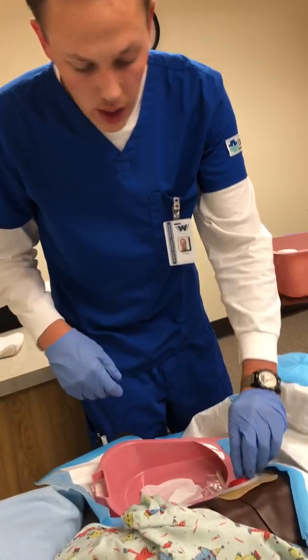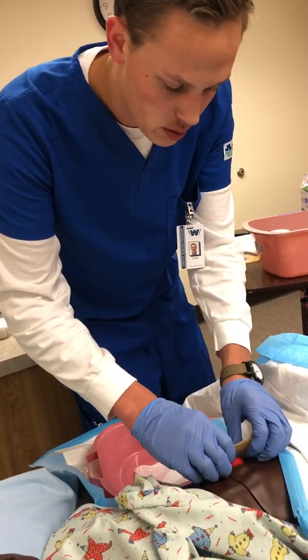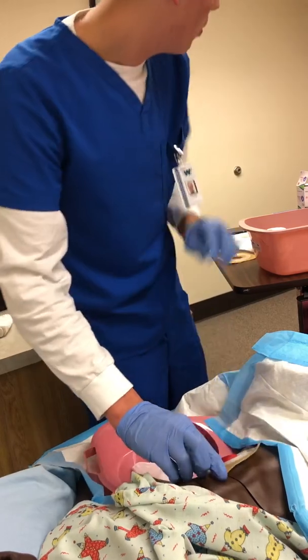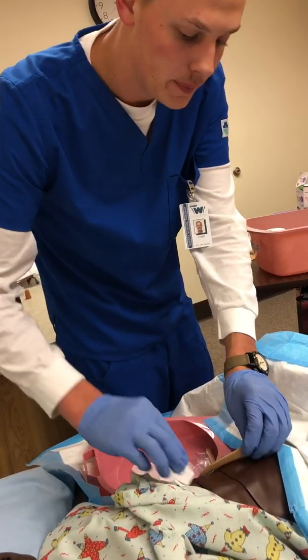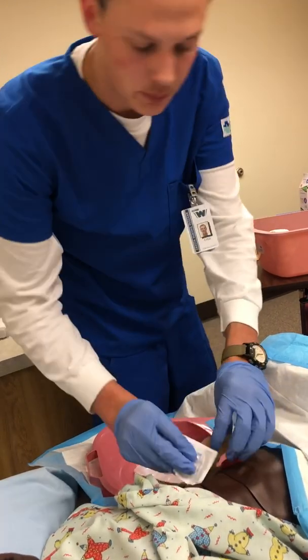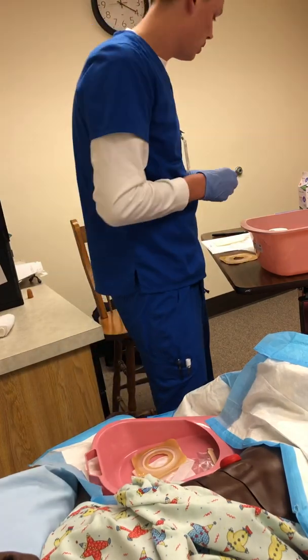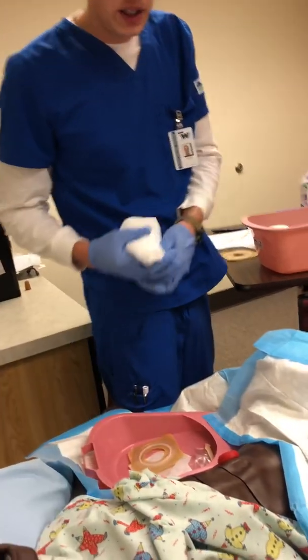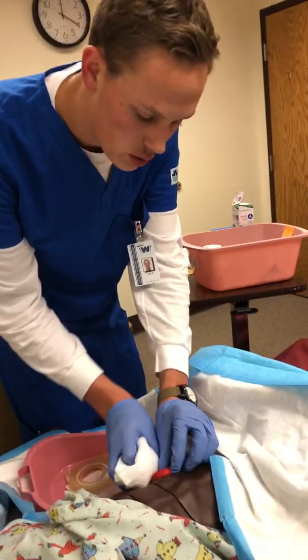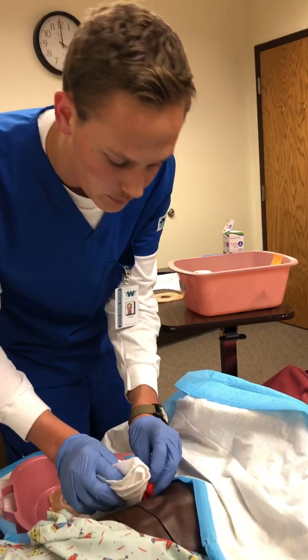And then once I do that, I can then remove the faceplate. And while I'm removing it, I would use adhesive remover as well to slowly peel it off. And that would go into the garbage. And then I can clean the patient around, and clean the patient's stoma.